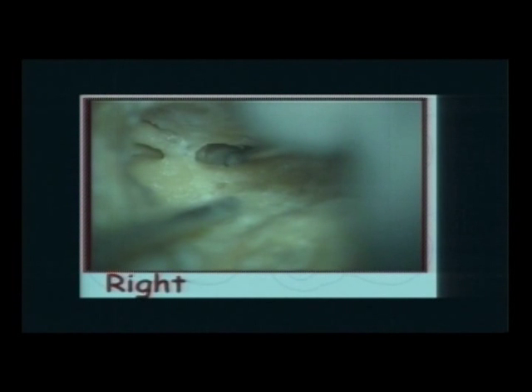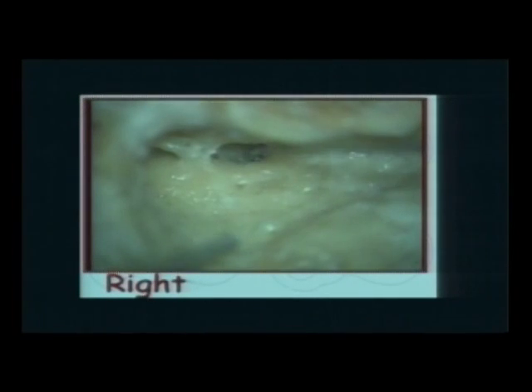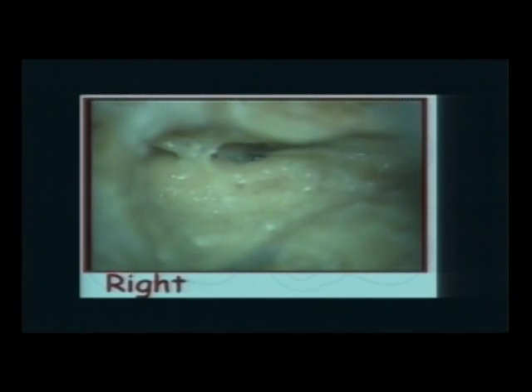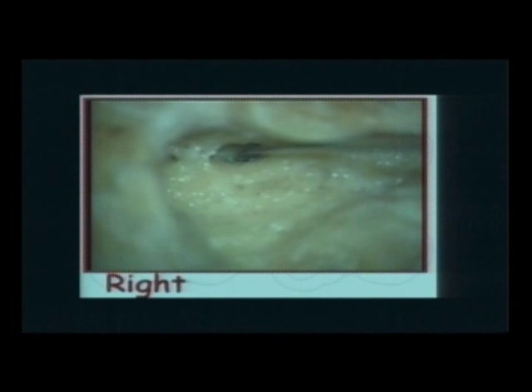Now I push it into the middle. I'm removing bone anterior to the facial nerve to see the round window niche. There's the round window niche. And if I move, you see the hypotympanic air cells down there. There's the crazy air cell that calls on you and tells you, come right here, dig for your cochleostomy. No, this is the round window here. Don't look down there. It's calling on you. Okay? And so this must be the basal turn of the cochlea and the promontory.